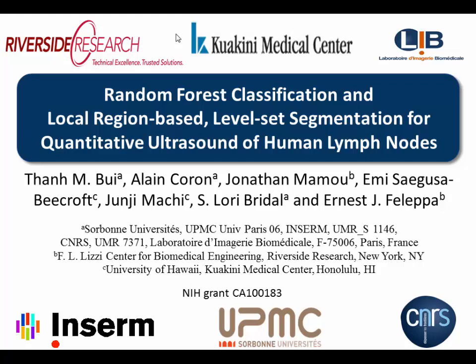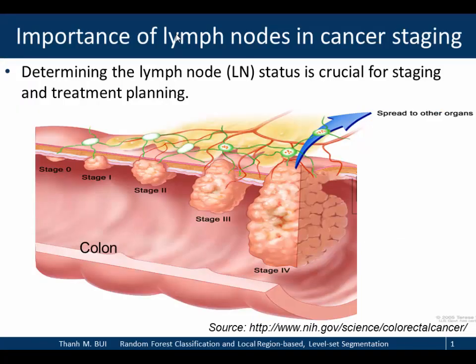Thanks to the previous talk, you already know a lot about lymph nodes, so I'll just quickly introduce the motivation of my work. Determining the lymph node status is crucial for staging and treatment planning of cancer. This slide shows a section of colon with colorectal cancer, and you see the lymph node and lymph vessel in green.